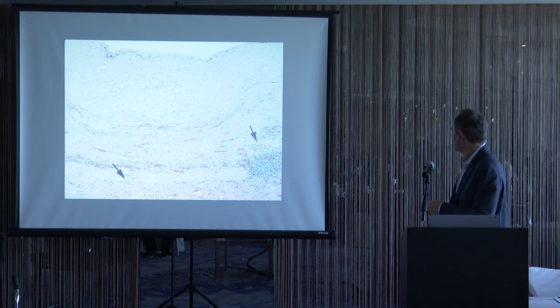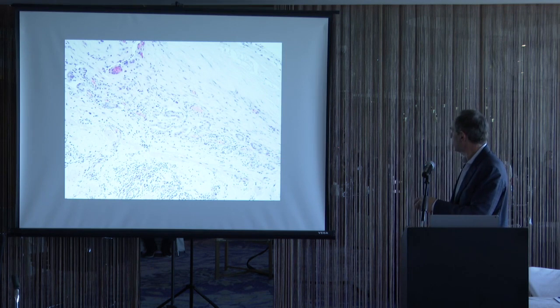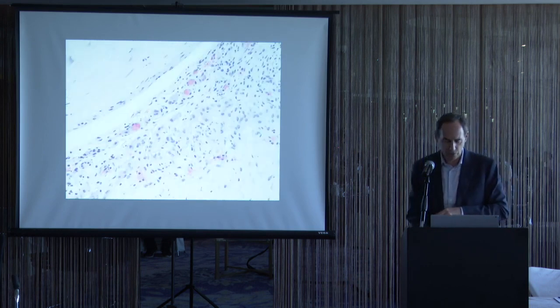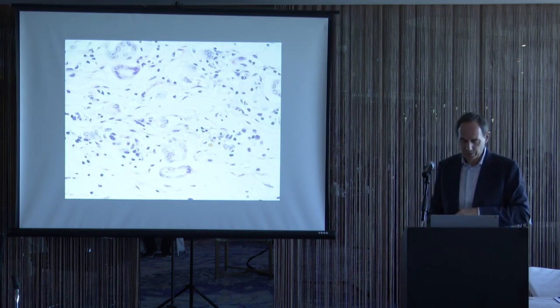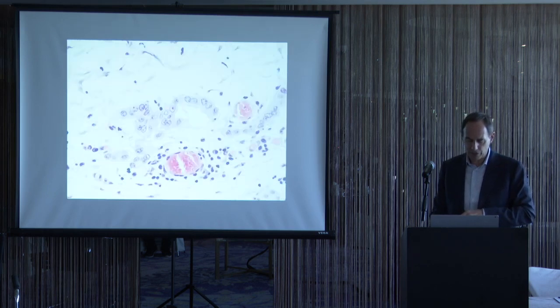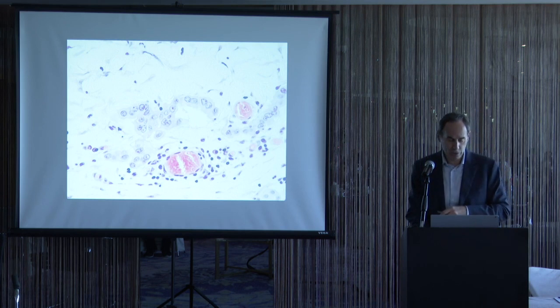Again, in hydroceles, you get this linear array of reactive mesothelial tubules, as shown here. Cytologically, they're going to be bland, linear in between the dense fibrosis and more inflamed tissue. But they can be quite proliferative, forming tubules, sometimes even little papillary formation. Not overtly malignant, but malignant mesothelioma could look like this.